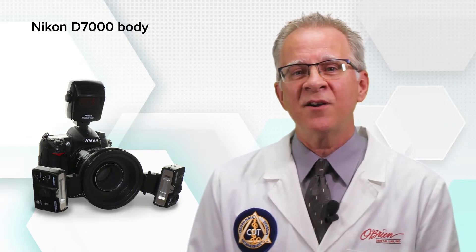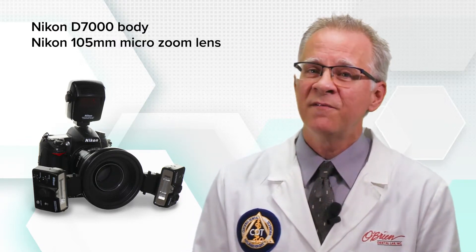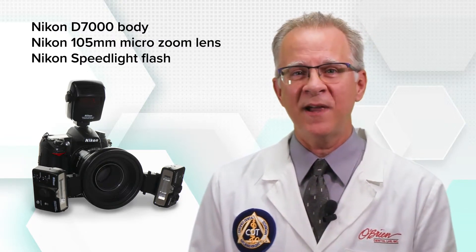Here's a great setup, but any similar system will serve you well. This is a Nikon D7000 SLR body, a Nikon 105mm micro zoom lens, and a Nikon Speedlite flash. This particular camera holds two SD memory cards for a ton of storage and ease of data transfer.